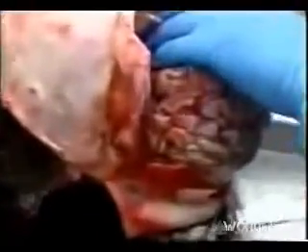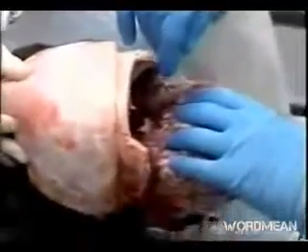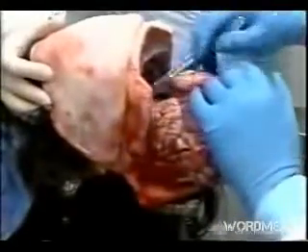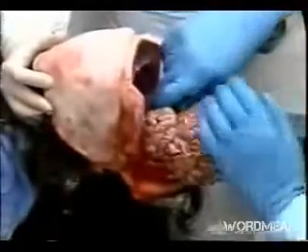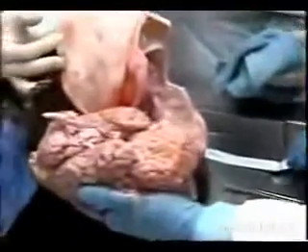First thing he'll do is reach down in and cut the optic nerves. They're the first things holding the brain in place. Once those have been cut, he'll cut some of the other cranial nerves, and then he'll need to make an incision through the tentorium, which is a tough membrane that holds the cerebellum in the posterior fossa of the skull. Once that's done, he can put his knife down into the foramen magnum and transect the spinal column and essentially deliver the brain.